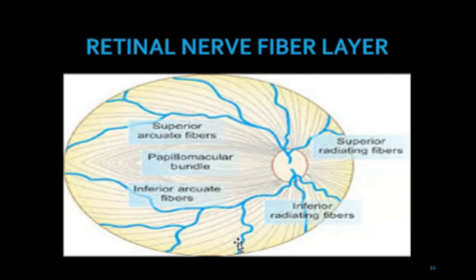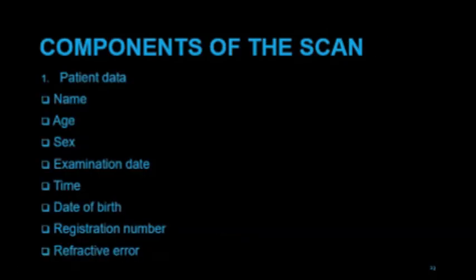So glaucoma usually affects the superior arcuate fibers and the inferior arcuate fibers first. It's when we get to end stage that they begin to affect the nasal fibers. This is why you see tunnel vision in advanced or end stage glaucoma.